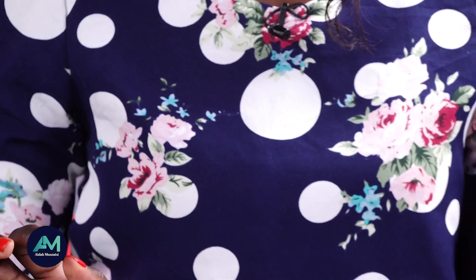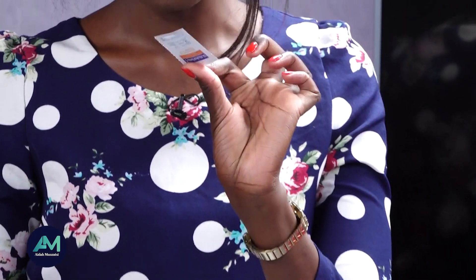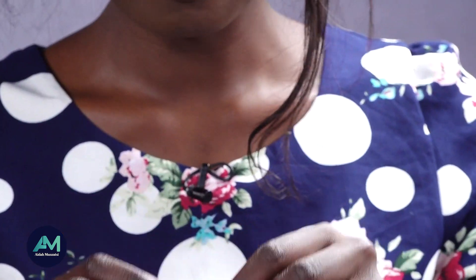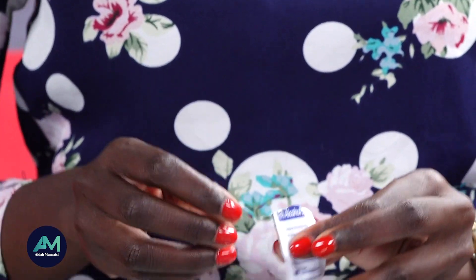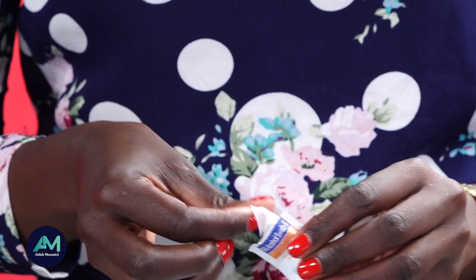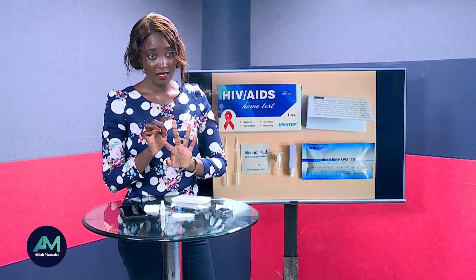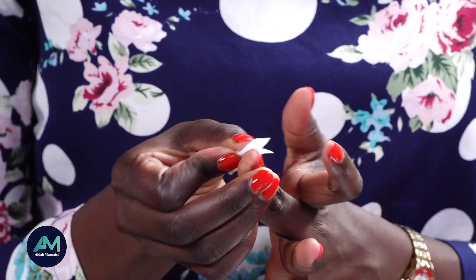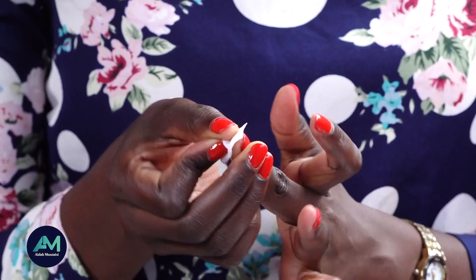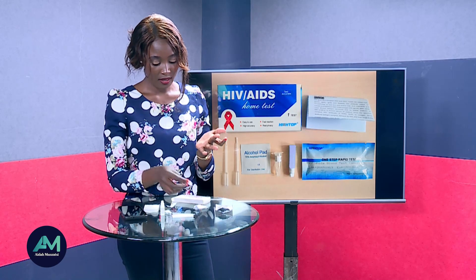The first thing to do is take your lancet, but before that, use the alcohol swab. Cut the alcohol swab open, then wipe your middle finger — the middle finger is most advisable. Make sure you've washed your hands beforehand so they are clean, then wipe the finger.